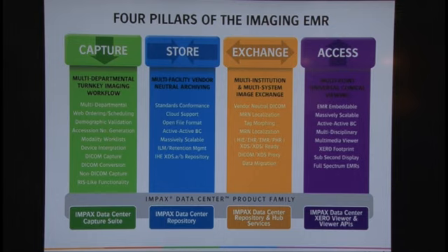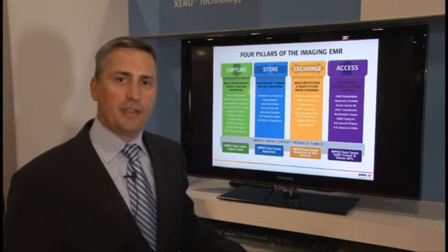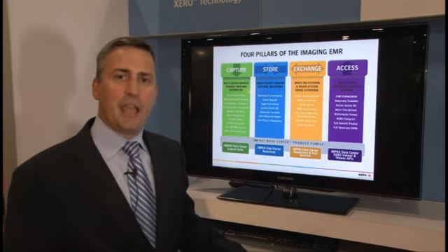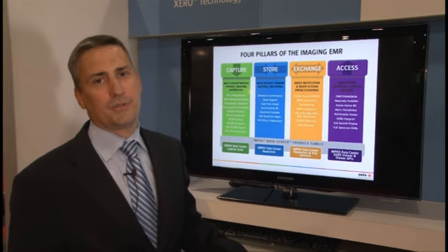And by providing medical imaging in a universal viewer that is tightly tied to the capture and storage components, the medical imaging repository can provide point of access to medical imaging anywhere that the physician needs access. And lastly, the access services should provide the viewing technology as a zero footprint, zero download viewer so that images can be accessed anywhere, anytime, on any operating system and with any modern browser.